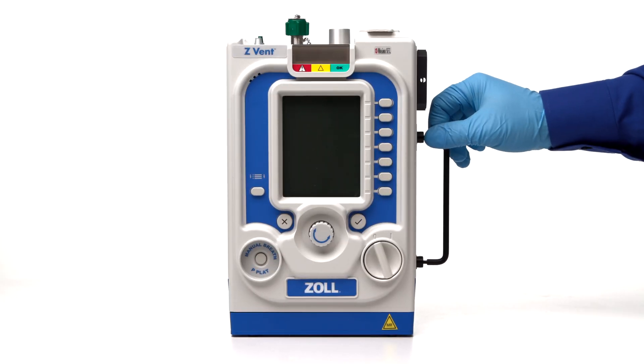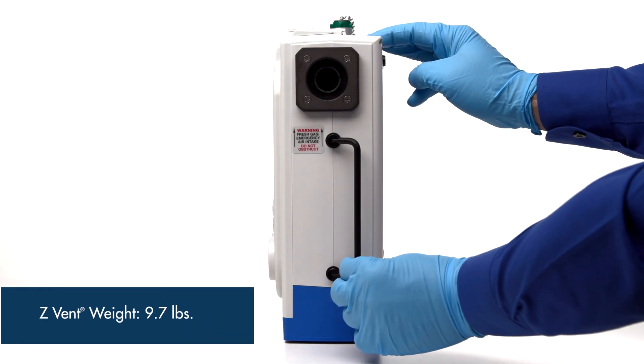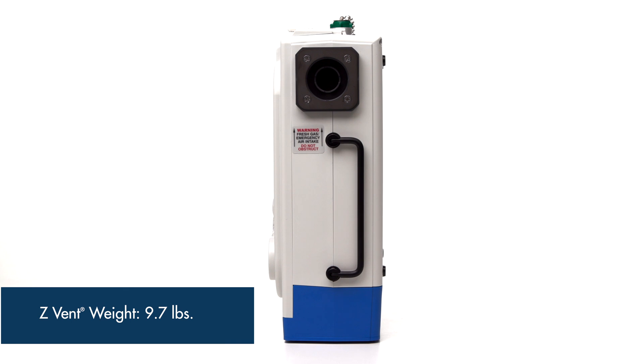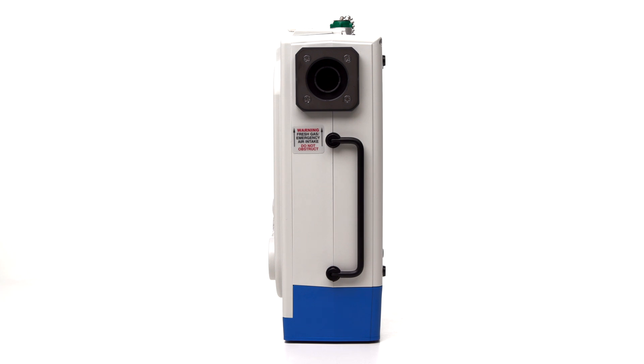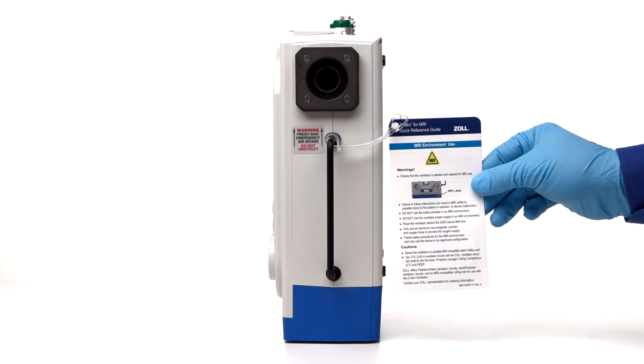The air intake port is also the device's handle. The Z-VENT weighs only 9.7 pounds and can be easily transported throughout the hospital. Attached to the handle of every new Z-VENT is the quick reference guide, which provides the user with easy access to basic but important information regarding device navigation and functionality.